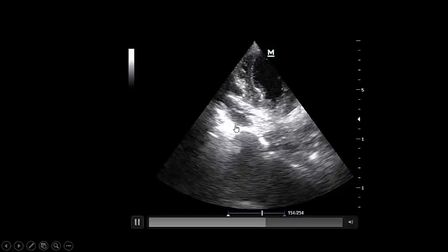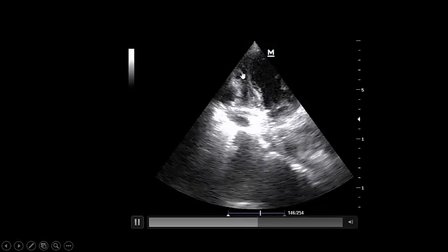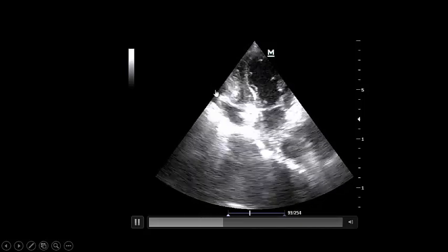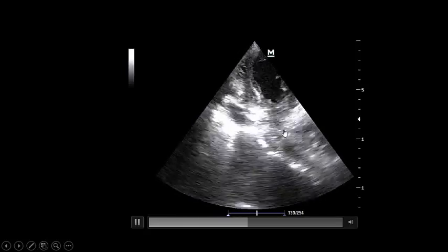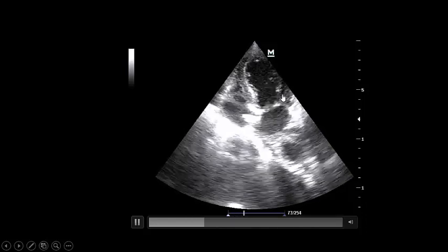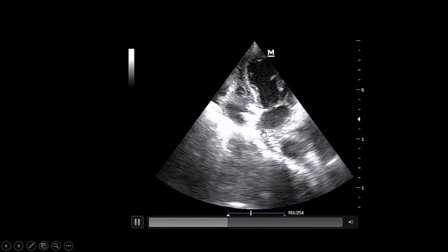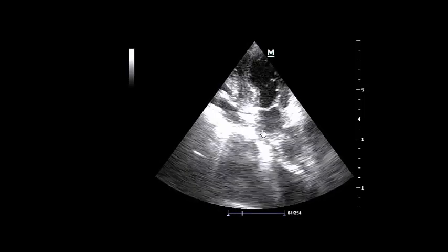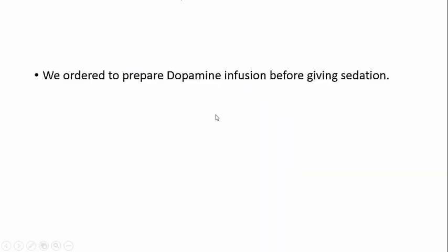Second, we went to the heart. In this four-chamber view, you can see the right ventricle is kissing — moving up and down due to dehydration, which is good. However, the left ventricle is almost akinetic at the apex, with a hypokinetic septum but an active lateral wall. This could be stress cardiomyopathy, common in this type of patient, or it could be an acute myocardial infarction. We ordered preparation of an inotrope infusion before giving sedation. So now we know: patient is dry — give IV fluid bolus; patient has left-sided heart failure with low ejection fraction — we need inotropic support before anesthesia.